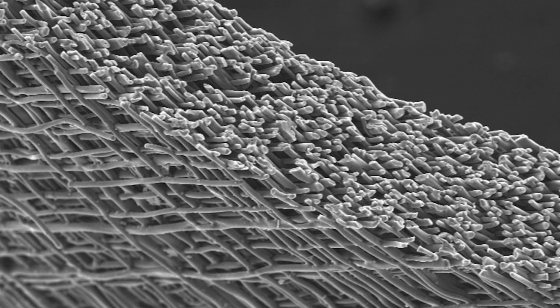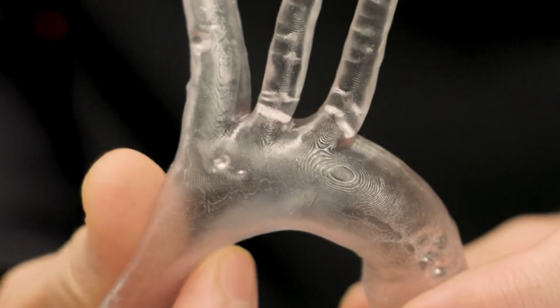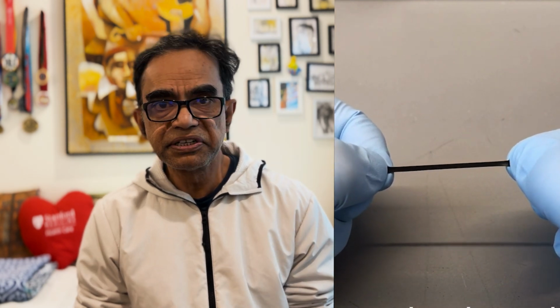Now this biodegradable graft, structurally this material is a metalloelastomer, a polymer that is similar to natural rubber and composed of molecules that behave like random coils. When the elastomer is exposed to metal ions, the random coils bind together. The elastomer then behaves like a three-dimensional fishing net and mimics the natural elasticity of arteries or veins. The material springs back into shape after it is stretched, but it is also very strong. You literally cannot break it.